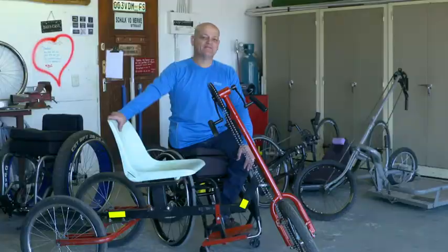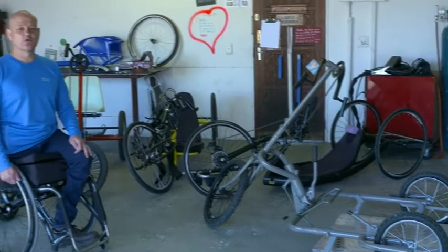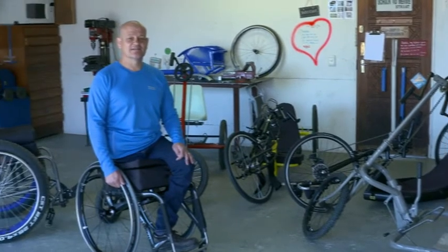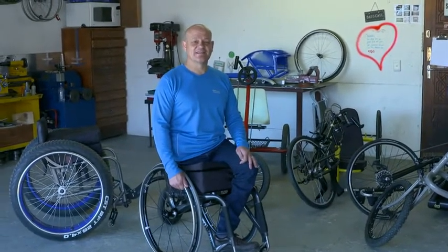That same year I was introduced into the world of the disabled, and now I manufacture wheelchairs and assistive devices in order to help them. For the past 15 years I've been designing and manufacturing different kinds of sport wheelchairs and hand cycles, and I've been competitive myself in the racing wheelchair and hand cycling division.